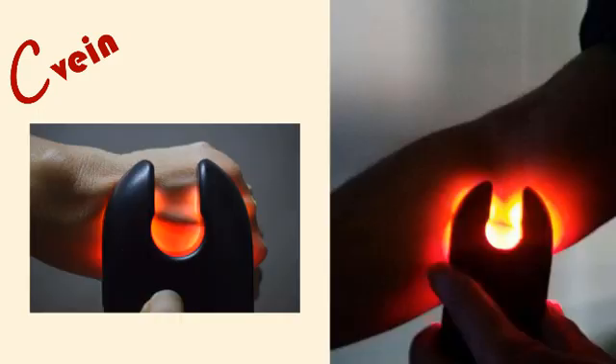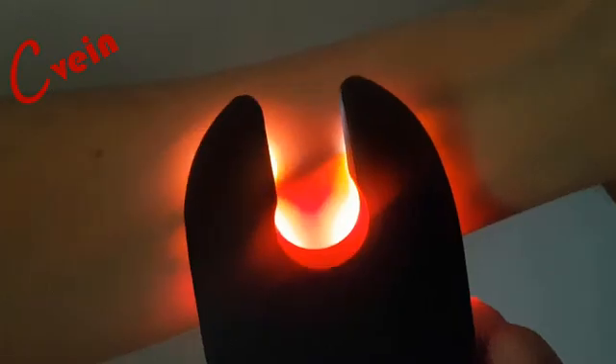Unlike projector-type vein finders, C-Vein is affordable, drop-proof, shows the veins on angled body parts, and most importantly lets you interpret the depth and caliber of the vein.